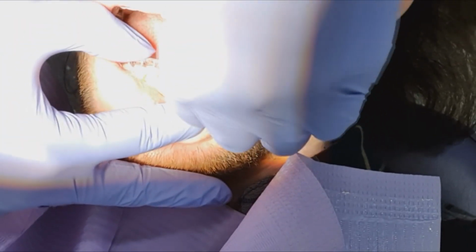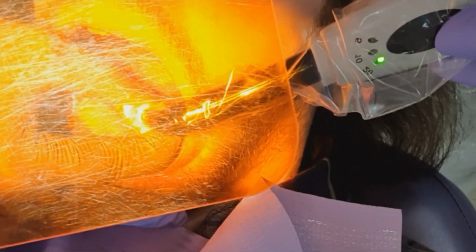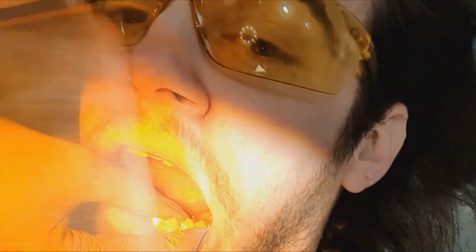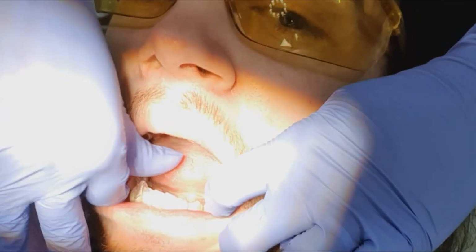So on go the aligners with the composite material already inserted in there. They bring this light to that material and it does some kind of weird magic and cures it pretty quickly. You know, it's like 10 seconds and it's done, it's bonded to your teeth. In this particular clip they're doing 2 teeth at the same time, so you'll notice they've just moved to another tooth and are setting that attachment there as well. And that's it. That's 2 attachments done there in like 20 seconds. Out comes the cotton wool and then the template gets pulled out there.